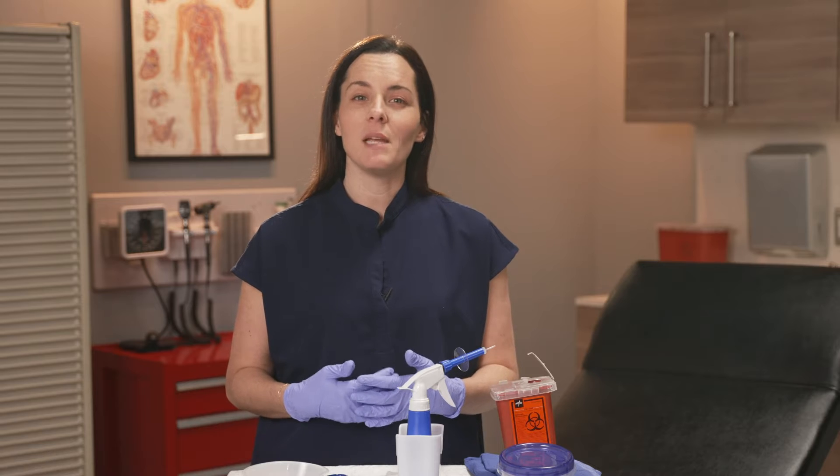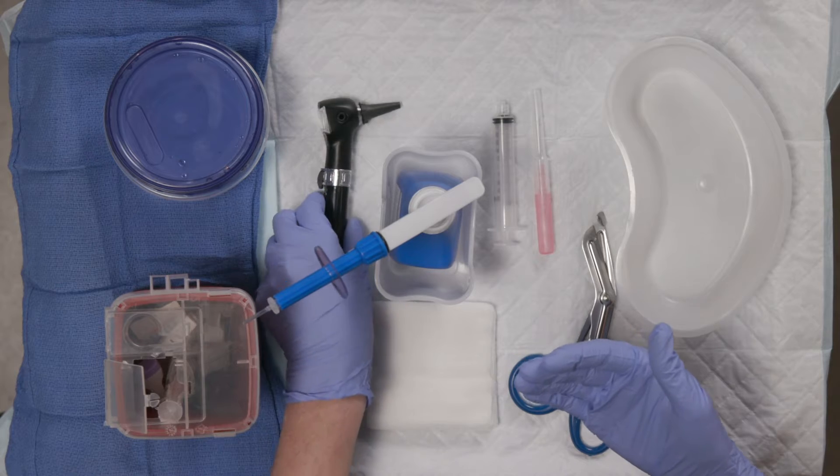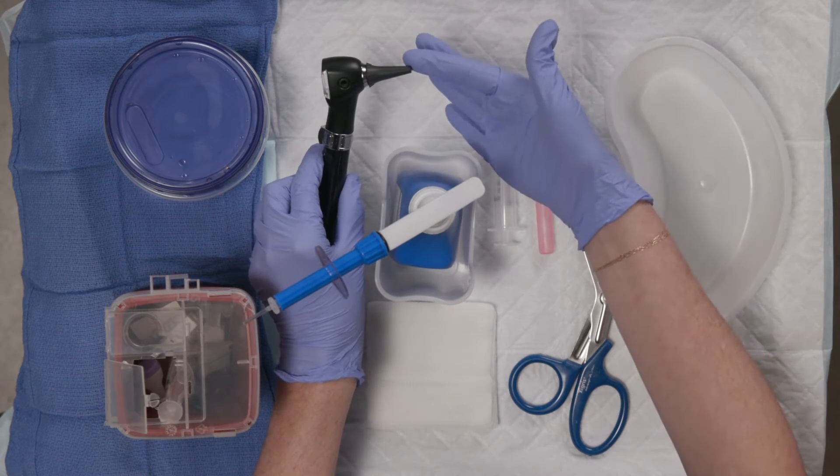Preparation is key to allow for a seamless and comfortable ear irrigation, so let's run through what you're going to need. You'll need a light source, usually an otoscope with its associated tips.